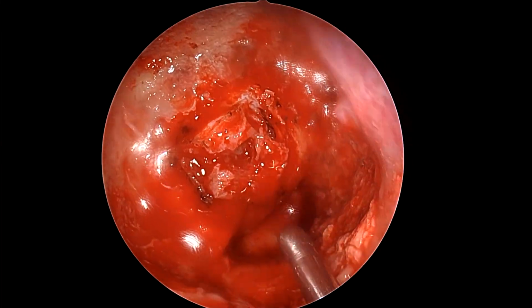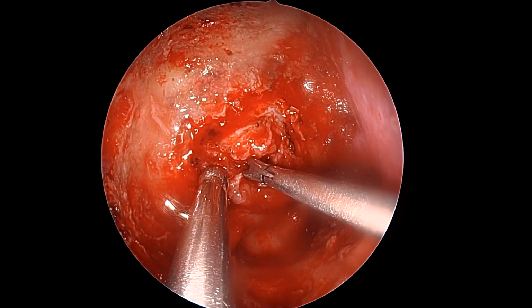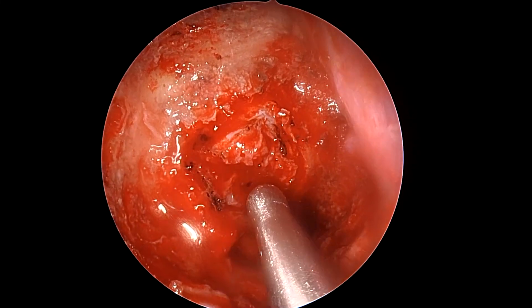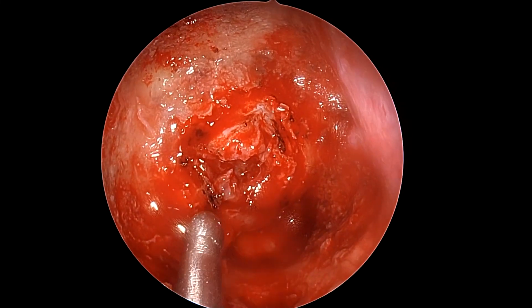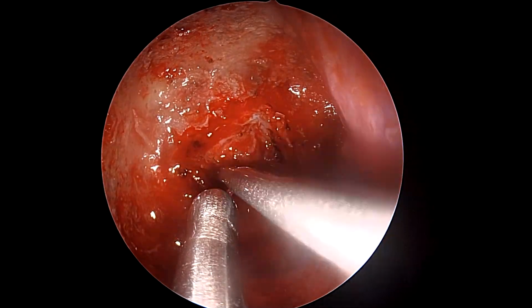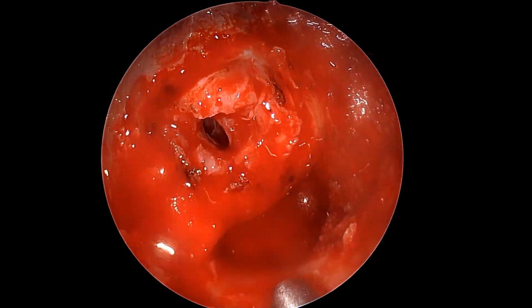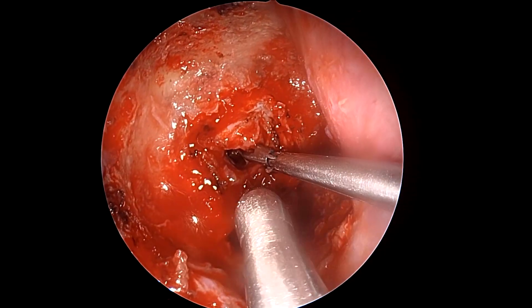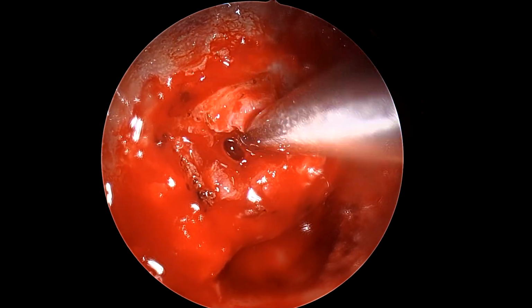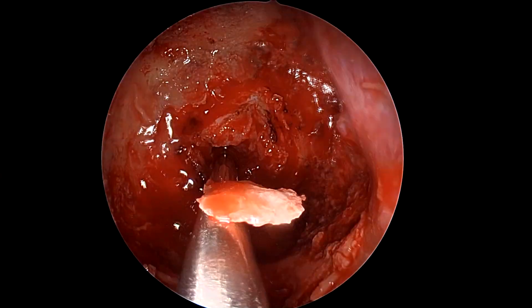You keep taking biopsy specimens. It's a rather mildly fibrous tumor. Again, at no point do we pull blindly. We'll take very, very small samples for biopsy initially on a very small tumor biopsy forceps. And now once we have access to the inside of the sella, we can see that now. And now probably we could start slowly and progressively scooping out the tumor, gradually making more and more space for us to move inside as well as to see inside this sellar cavity and not doing anything in a blind way.